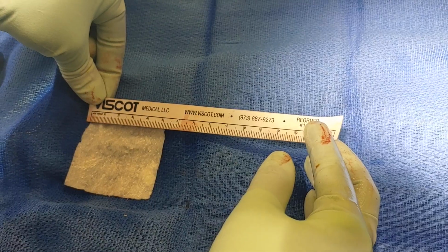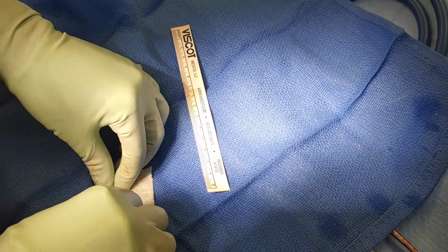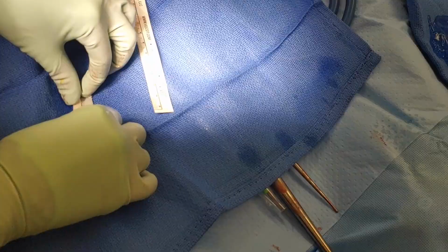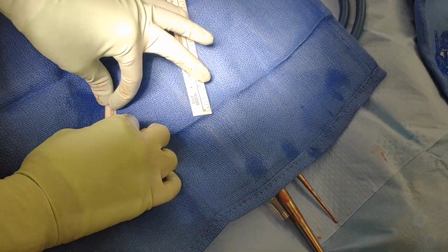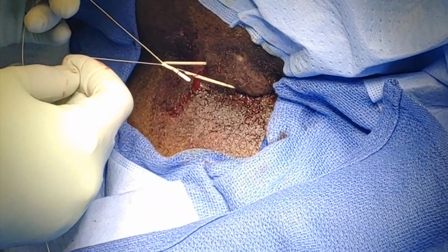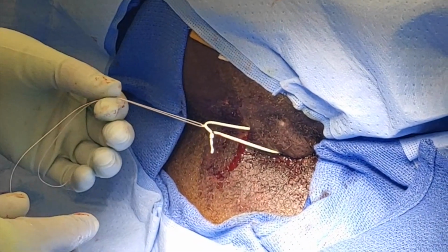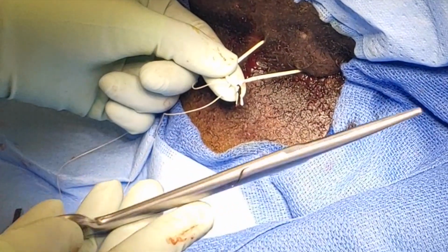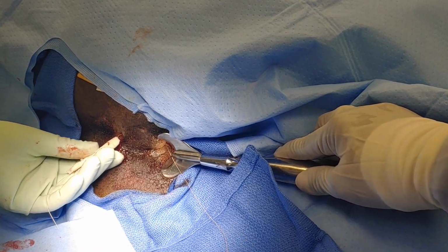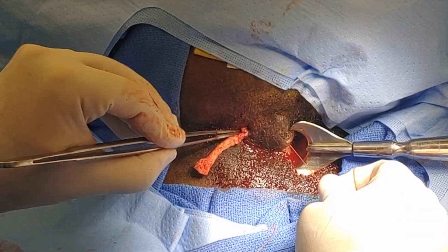The biologic matrix is hydrated with sterile saline and measured on the back table. It is then rolled in a cylindrical configuration in preparation for insertion into the fistula tract. An absorbable suture is placed through one end of the implant, secured and tied to the seton. The seton is then cut and used as leverage to pass the implant through the tract. Often this requires a push-pull technique with insertion into the external opening of the fistula using forceps.